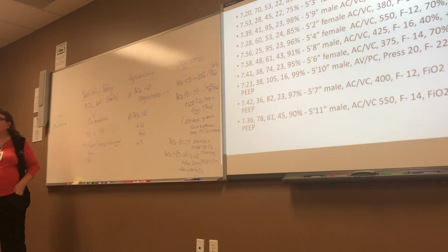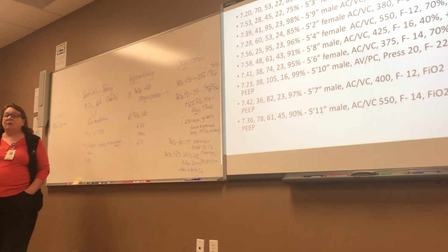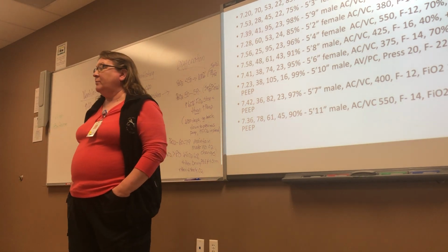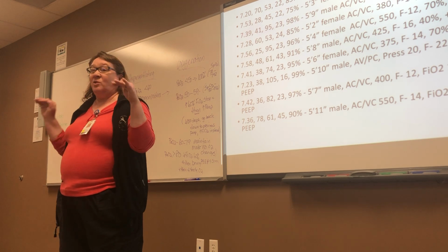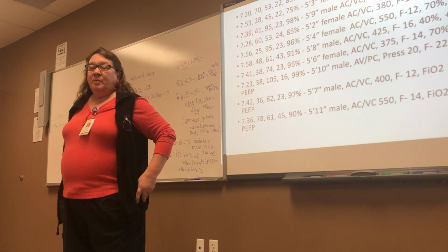Devin? We talked about bringing the PEEP down and monitoring. How long are you monitoring for? Oxygenation doesn't make changes automatically. I would wait 10, 15 minutes and then see if you're stabilized, and if not, then you can keep making your changes. CO2 is going to be quick. Depending on if you have an end-tidal CO2 in place, which most vet patients do now, you can trend it, see where it started, and whether it's going up or down based on your changes. And then when you think you're where you want to be, you can draw an ABG. Because if they don't have an art line in, I'm going to keep sticking them a billion times.